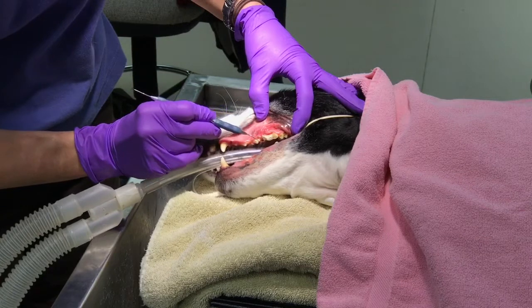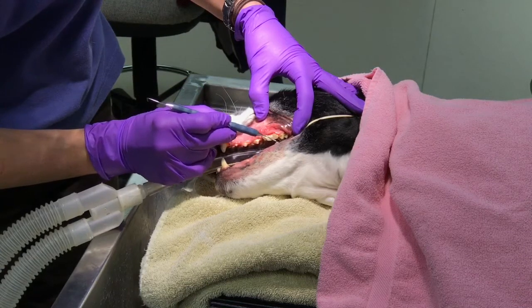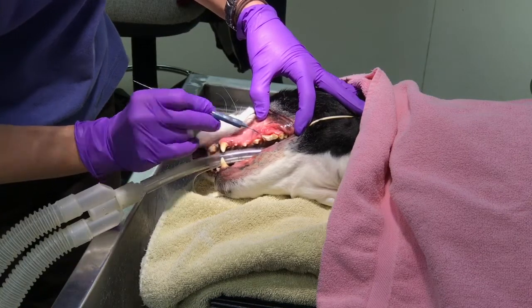But this has to go because it's not salvageable. It's below the root, or excuse me, below the gum line. And we have too large an area, as well as it's an older fracture with death to the pulp contents.